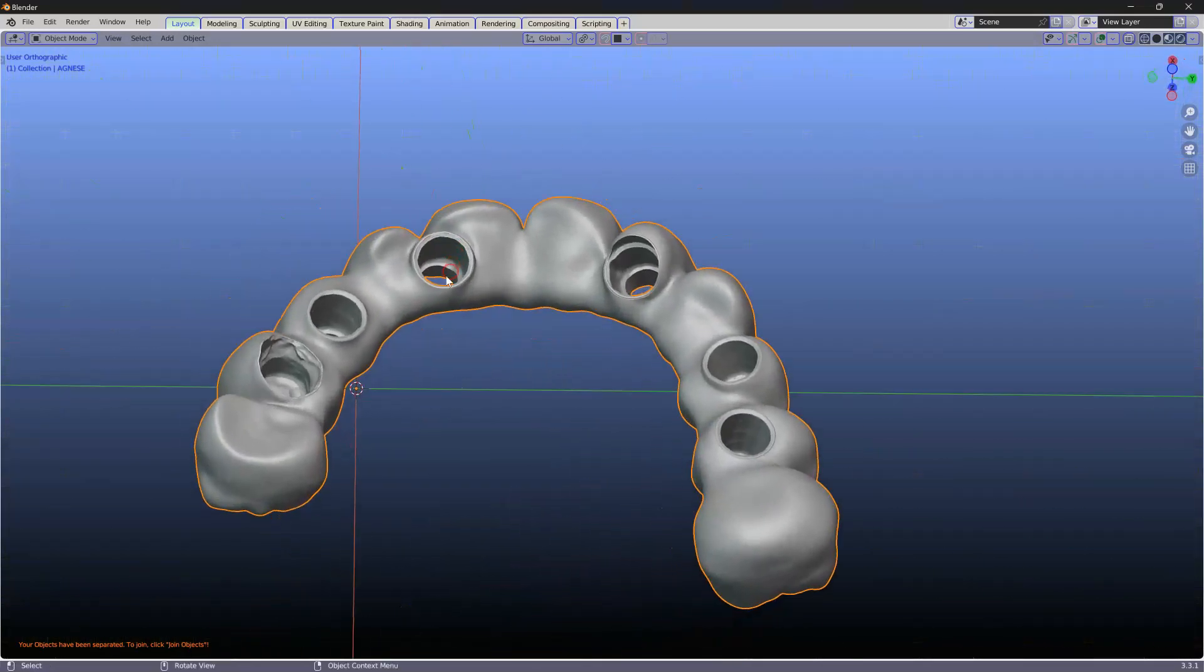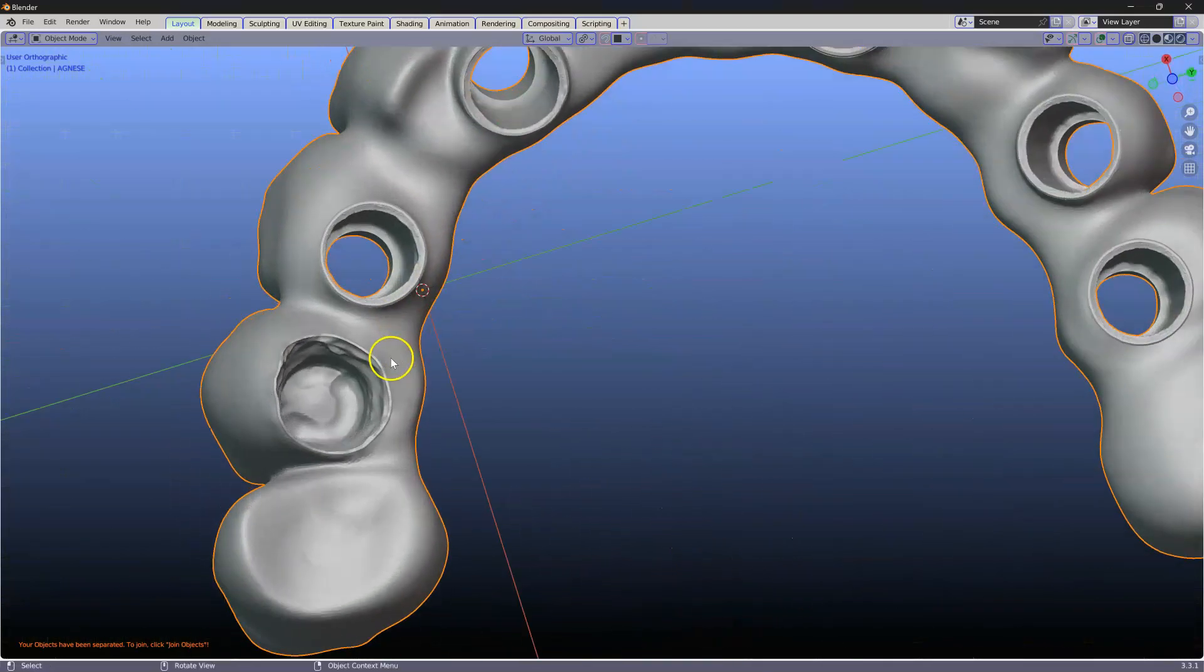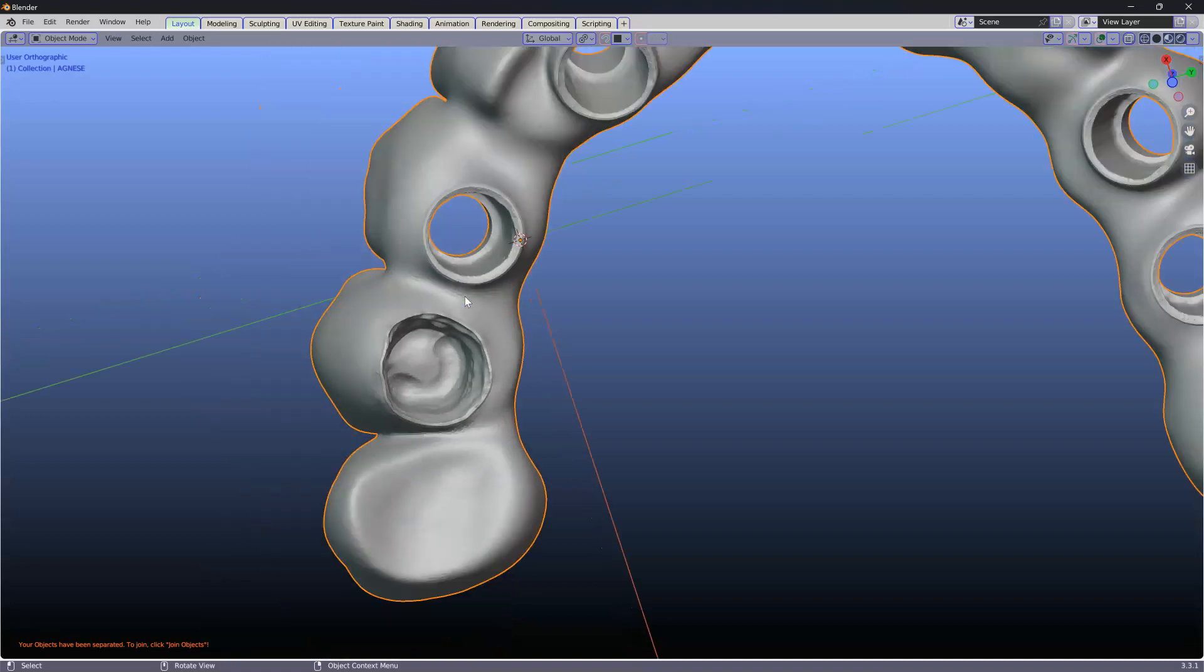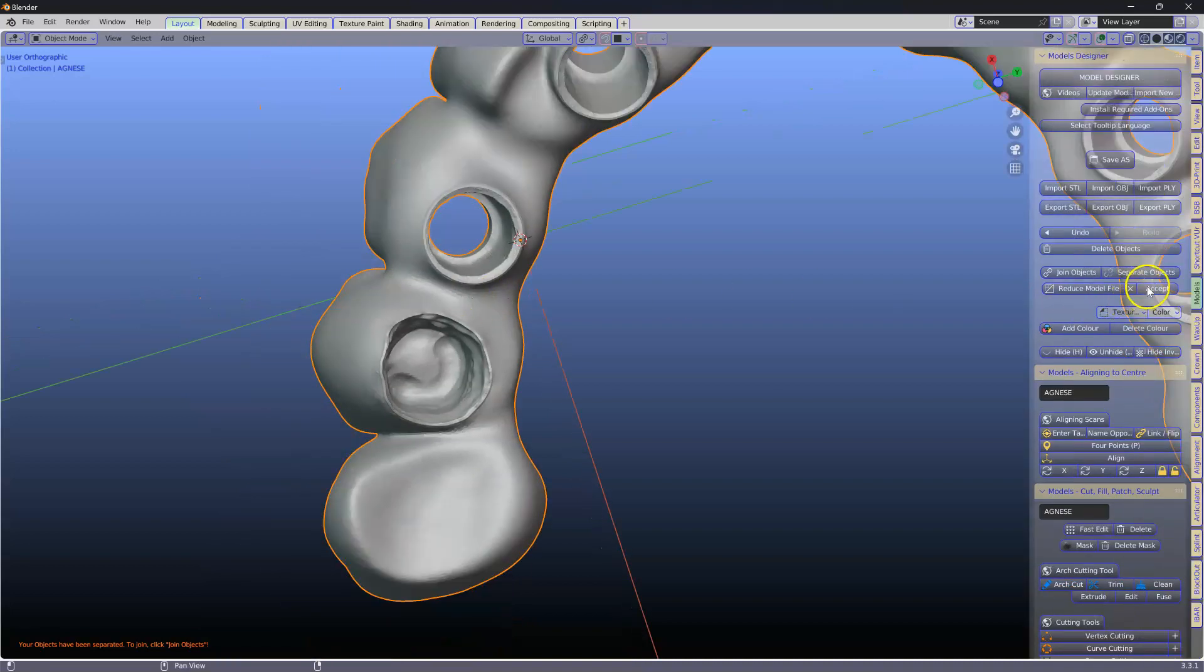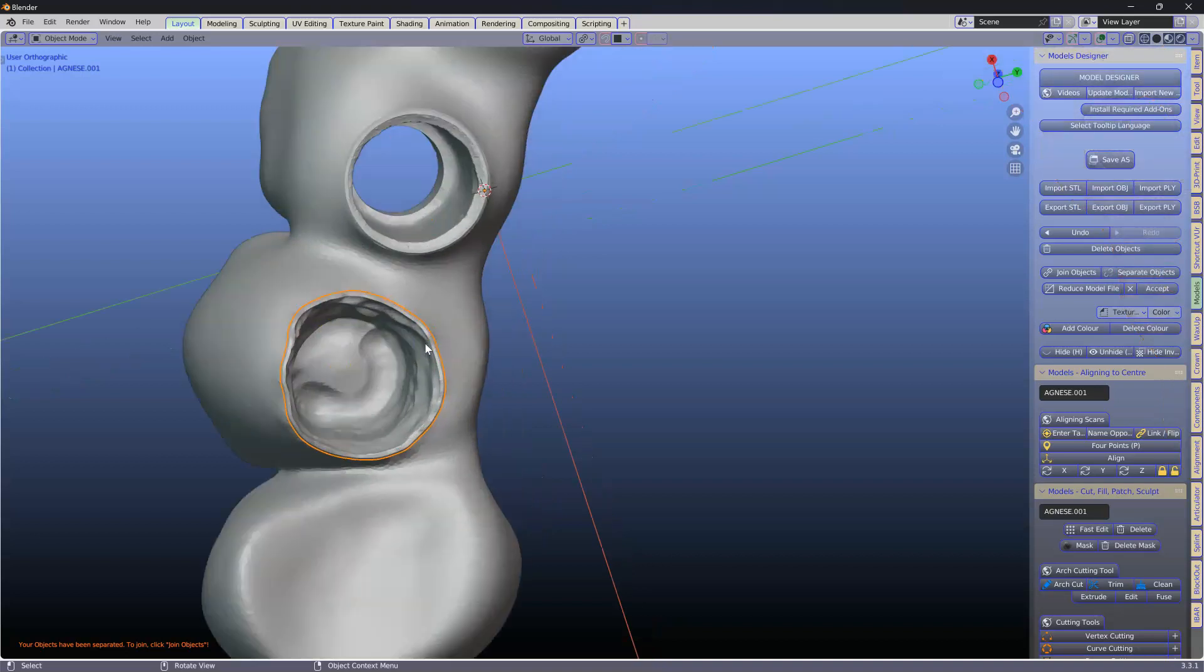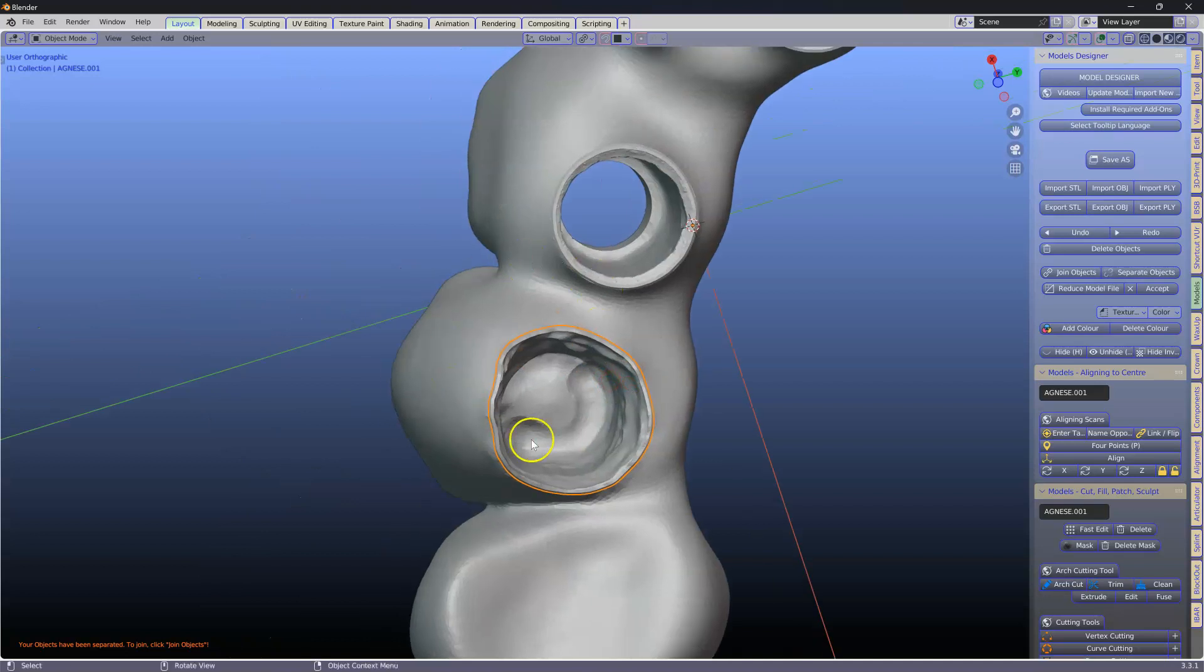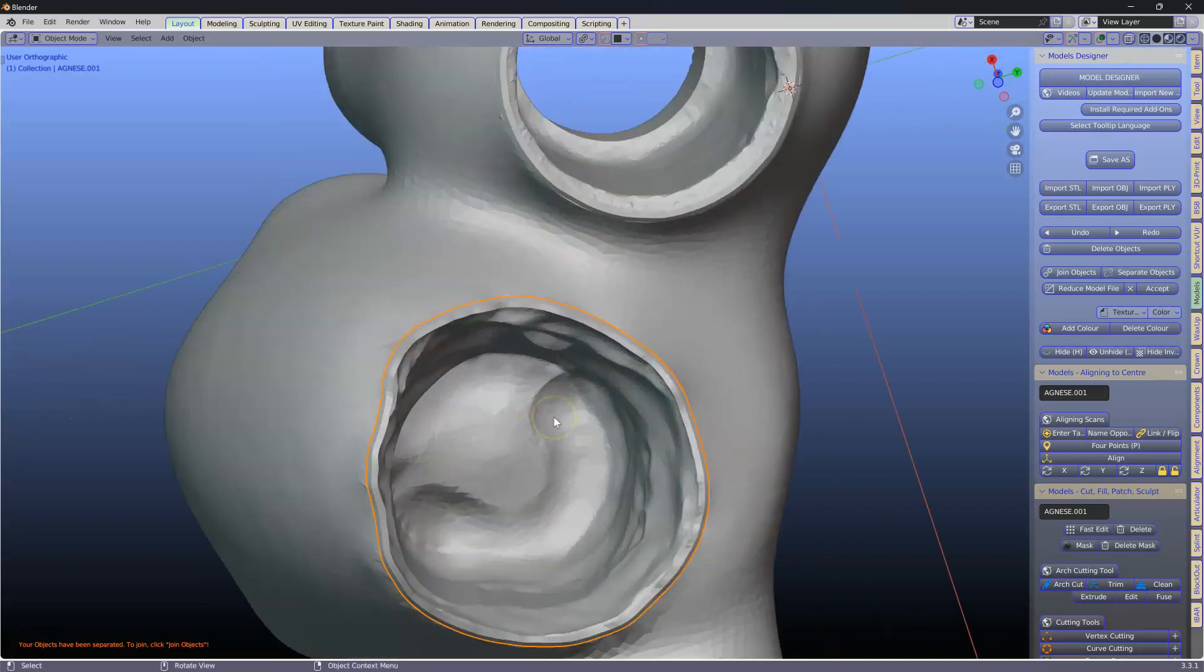Here I have another one of these. This is an ExoCAD one. I'm going to separate these so you'll see that this one is not merged with the actual mesh of the hybrid.